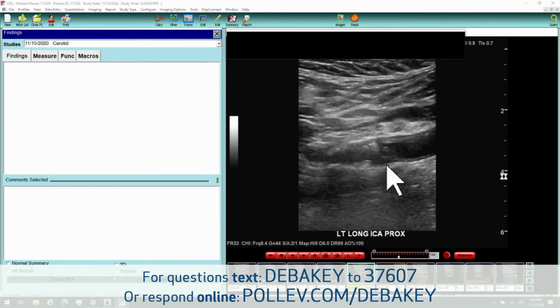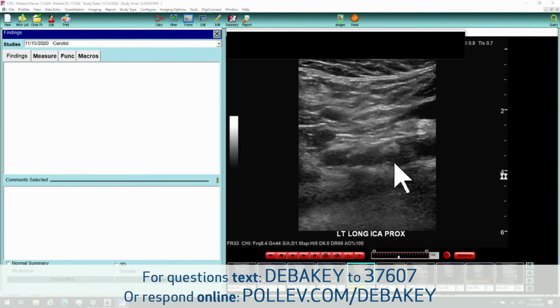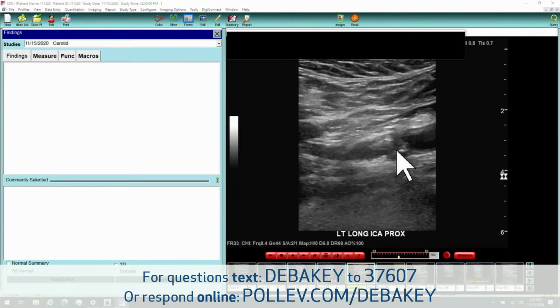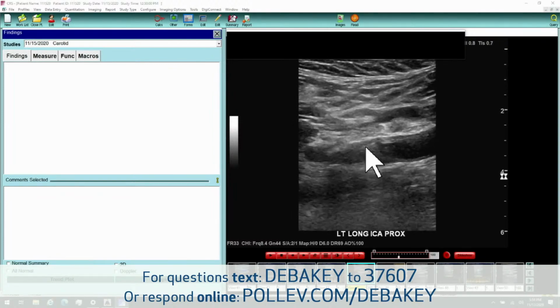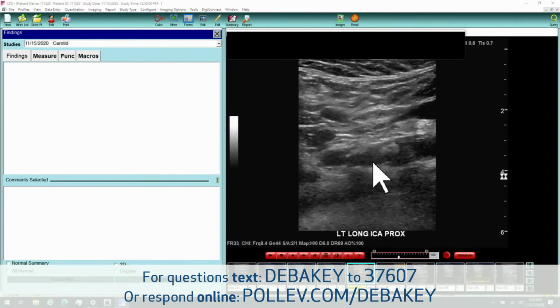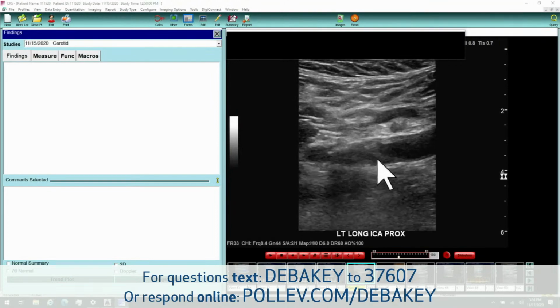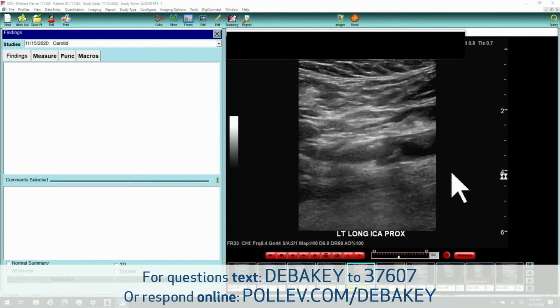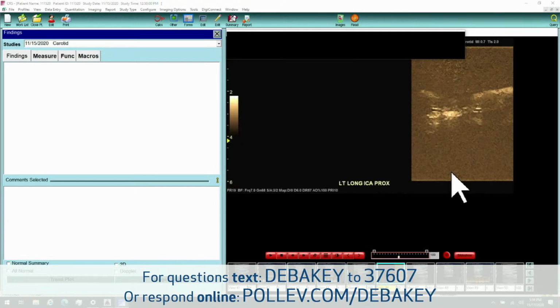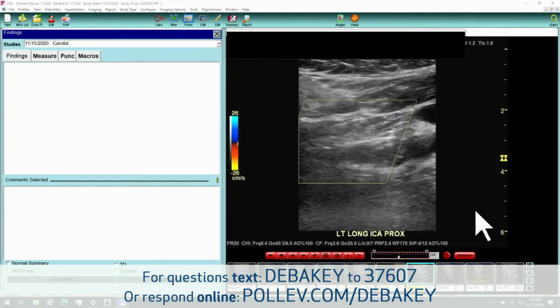Okay, here's the sweep of the ICA. Can you point out what I call the DEN sign, this longitudinal pulsation? Dan was teaching us how you look at the pulsatility of the artery, that this longitudinal pulsation may be a sign of something there. Okay, show me our fancy B-flow. What happened with the half of the screen?